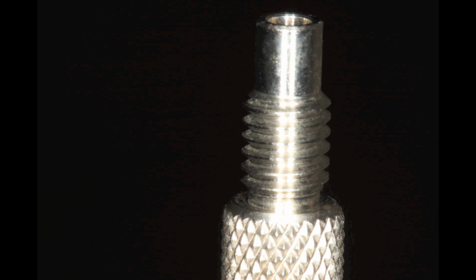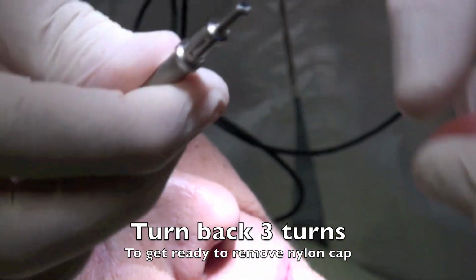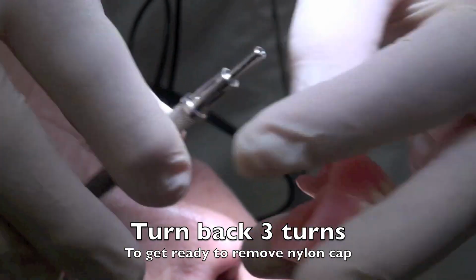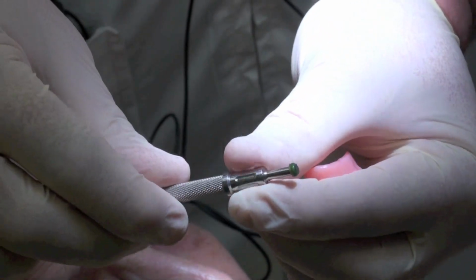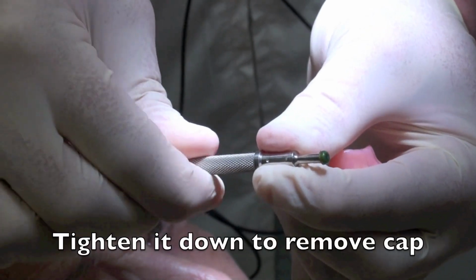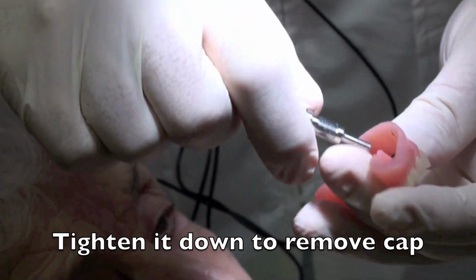So what you do is you take this, turn it back 3 turns, and the end is going to disappear on the end. So you can see how it's gone inside on the end. Then you stick this in. Sometimes it comes right out, but you pull that out like this. You can see that the first attachment has just come out just that fast. So I take this and turn it back down, and then that's going to pop off. So we get rid of that. So we took one out.